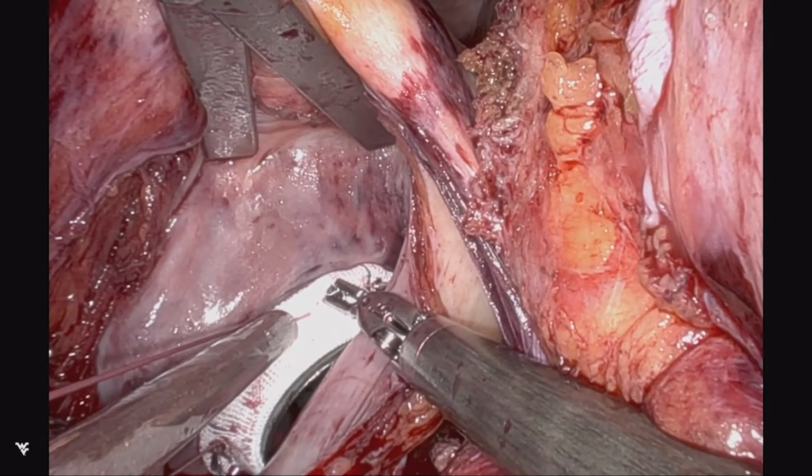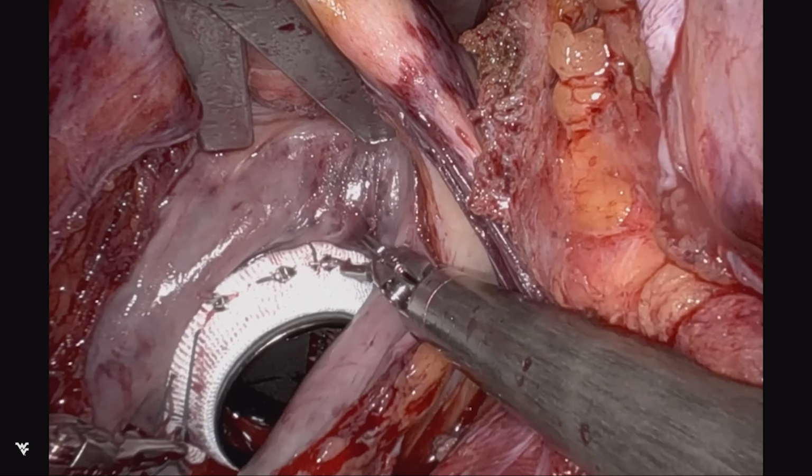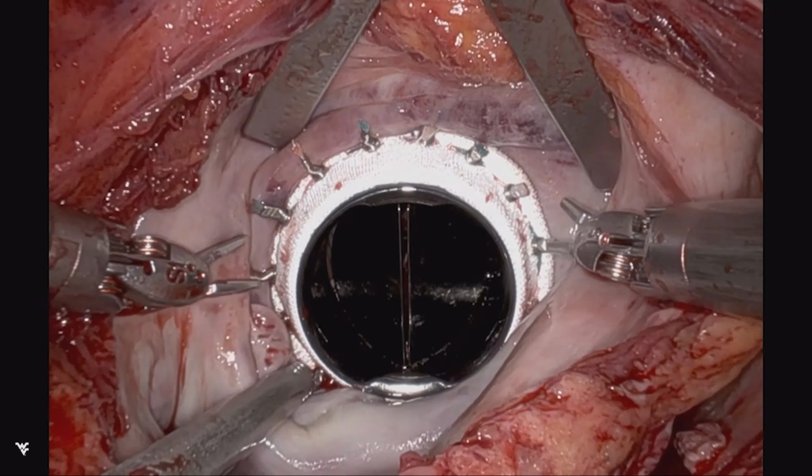And this valve is a mechanical prosthesis. This is the Onyx valve. Again, I have no affiliation to any industry, but this is the equivalent of a 33 prosthesis. And that completes the mitral valve replacement.